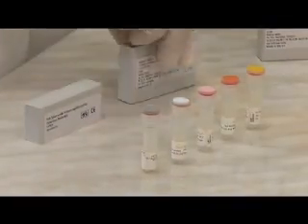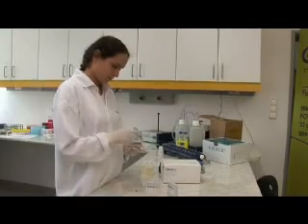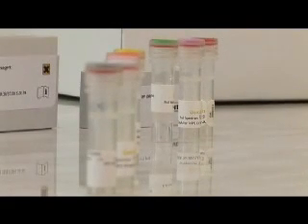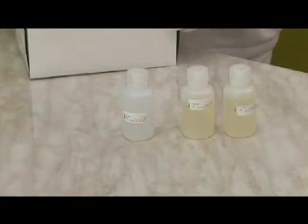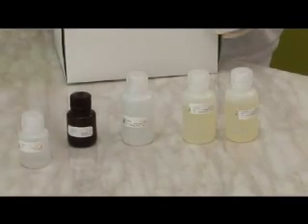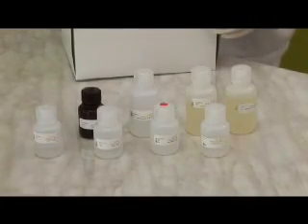The Detection Probe Kit contains both high risk and low risk and an internal control probe, which serves to exclude false positive results. The amplification system consists of the Full Spectrum HPV Amplification Kit, Detection Probe Kit, and the Detection Reagent Kit. The Detection Reagent Kit contains binding, elution, hybridization and conjugation buffer, substrate solution, washing solutions one and two, detection reagent, and plates which are coated with streptavidin.